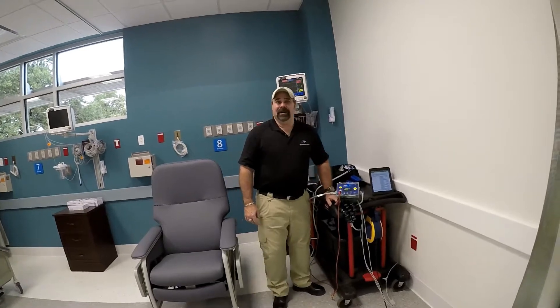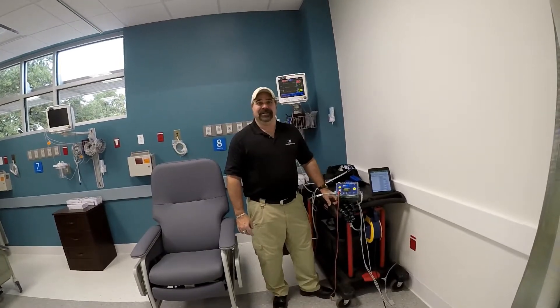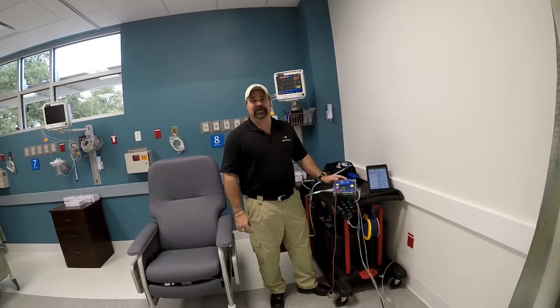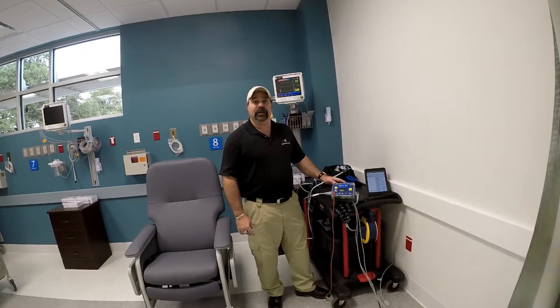Hi, I'm Greg Gordon with Insight Biomedical Services in San Antonio, Texas, and today I want to show you how the Safety Sim speeds up our inspection processes and basically makes our life a whole lot easier.